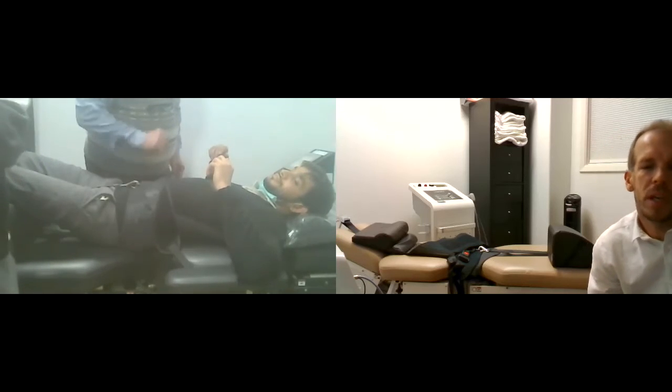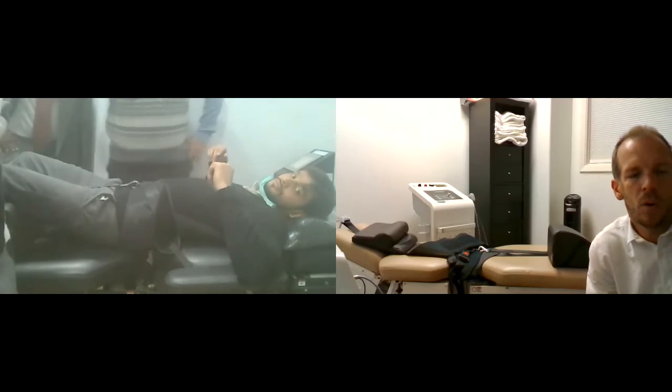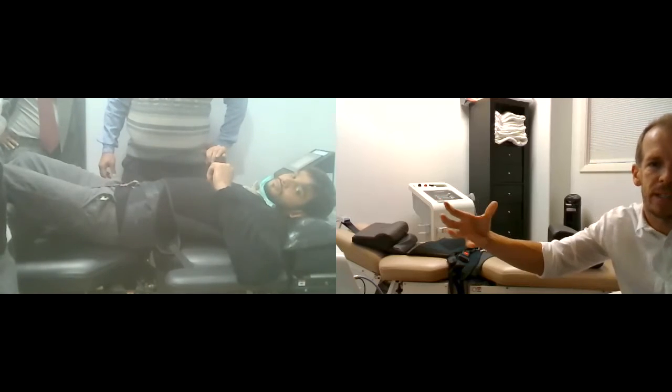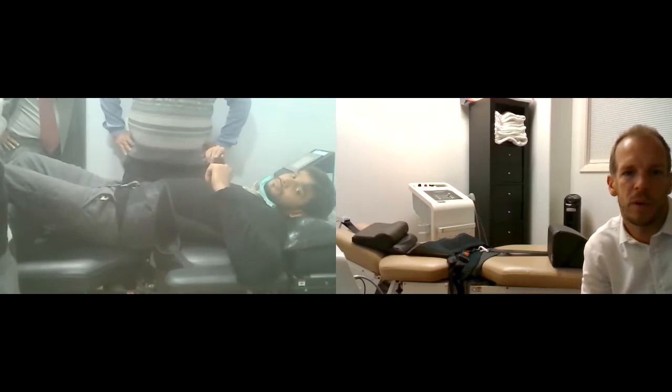Now, the most common problem is that people don't get that on tight enough or on the right bony structure, and that the patient just kind of slides through it. Okay, so that's going to be the part you want to be the most careful with. Okay.